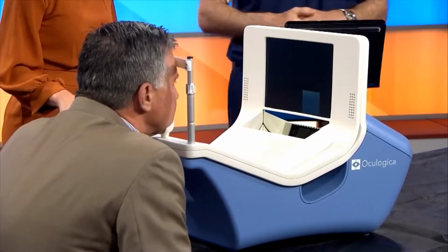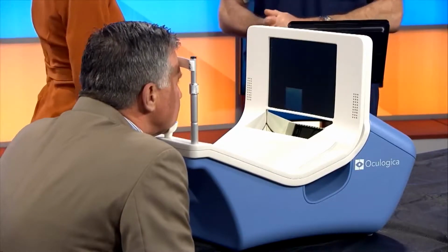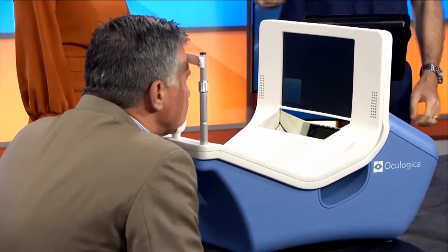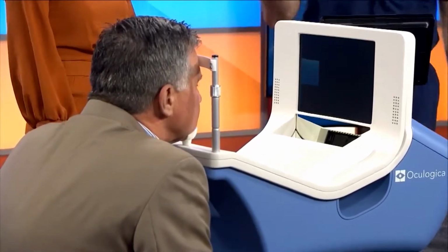Right. And the computer is computing how his right and left pupil are tracking together, and as they diverge, it's computing that, and that's a bad sign when the pupils don't work together. Ron, are you noticing any tracking in your eye? Does it feel like you're just normal? He needs to ignore it. Oh, he needs to ignore us at this point. Sorry. Okay, no, that's fine. But no, all he's watching is a tiny little bit of the movie moving around the screen. Right. There's a really high frequency camera that's in this machine that is tracking his pupillary movements.